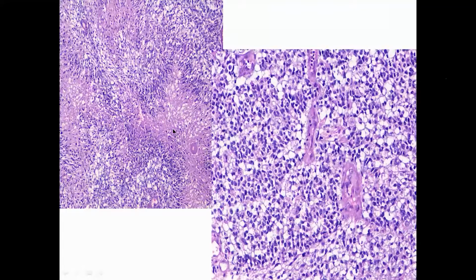Definitely, these tumor cells have adapted to this hypoxic environment, this acidic milieu, but still the tumors don't like this kind of environment, and they start running out of this area, and they start forming these palisades. These palisades are very characteristic of this lesion. So this tumor is showing oligodendrocyte-like morphology of these cells, or you can say some clearing of the cytoplasm.